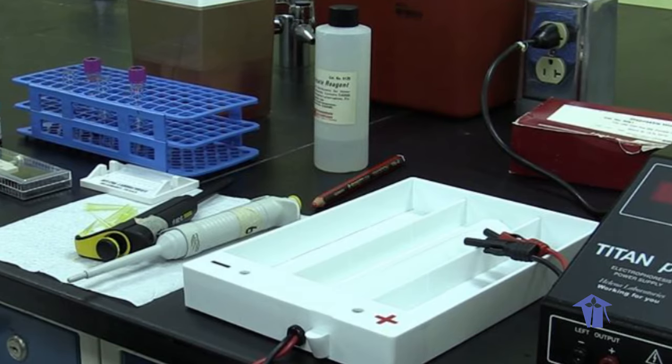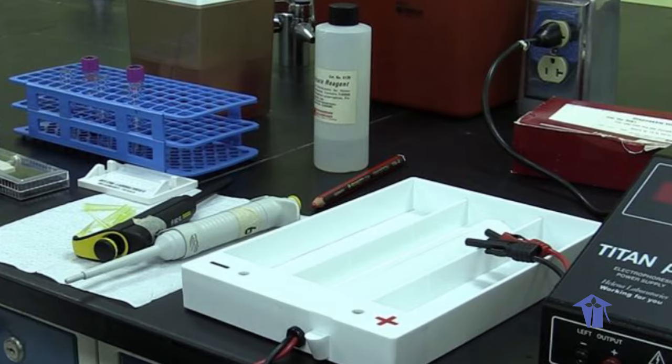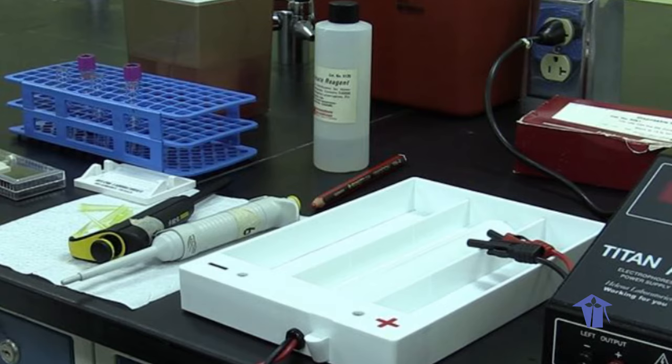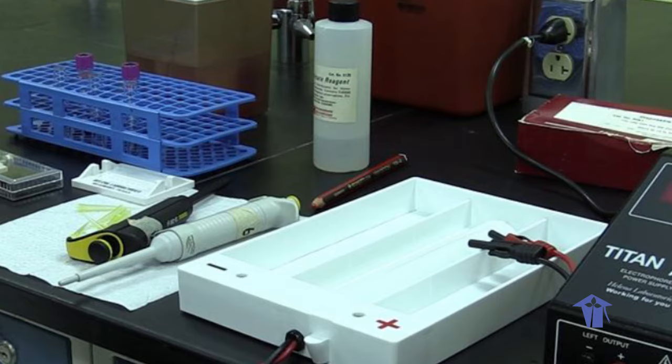and they include acid agarose gel, isoelectric focusing, and high-performance liquid chromatography. These are more expensive and they are not regularly used in most labs in Trinidad. The high-performance liquid chromatography, or HPLC, is a very fast, sensitive, largely automated method which requires minute quantities of sample. That is one of the advantages.